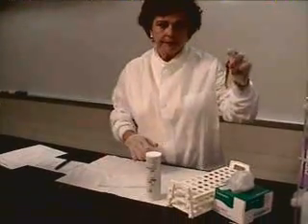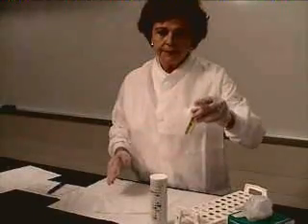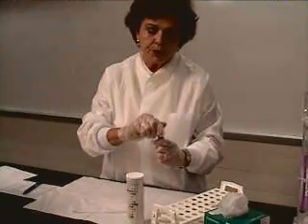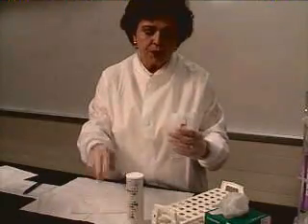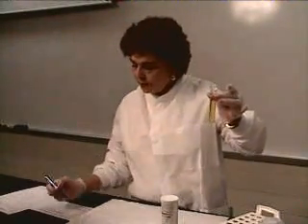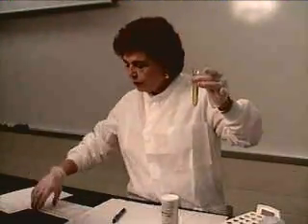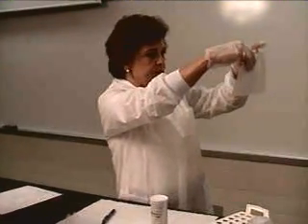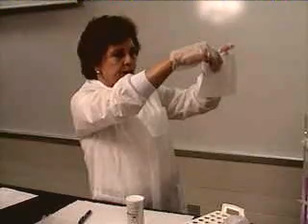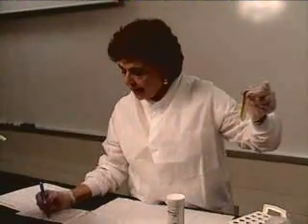We have a urine here. Whenever we do a urine, we always want to make sure we mix it and that it is at room temperature. The first thing I want to do is observe the urine for color and clarity. I look at this urine and I would call this urine yellow. Then I look at it for clarity — we see if we can see the lines through it, how well we can see the printing through the tube. And this I would consider hazy, so I would write down hazy.